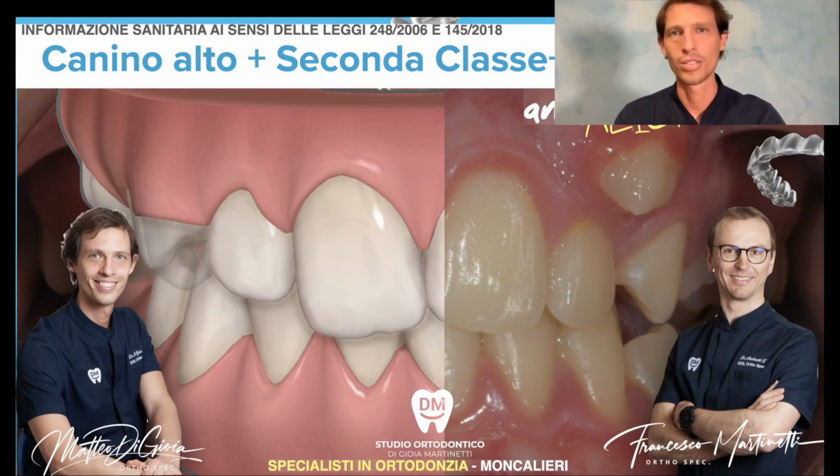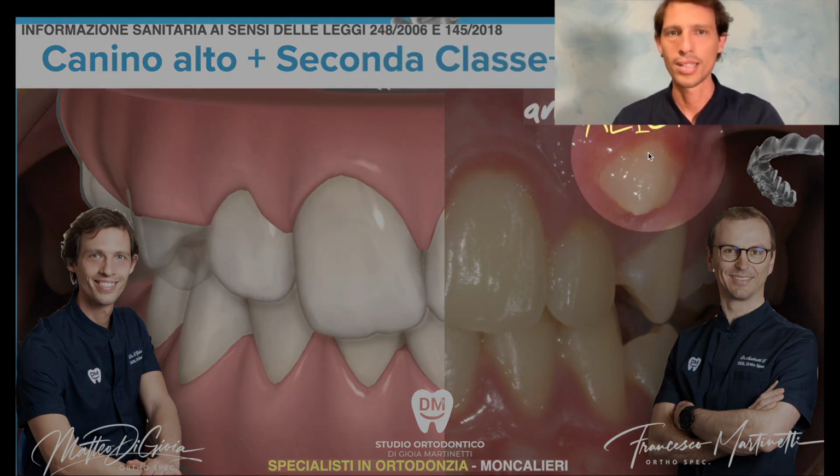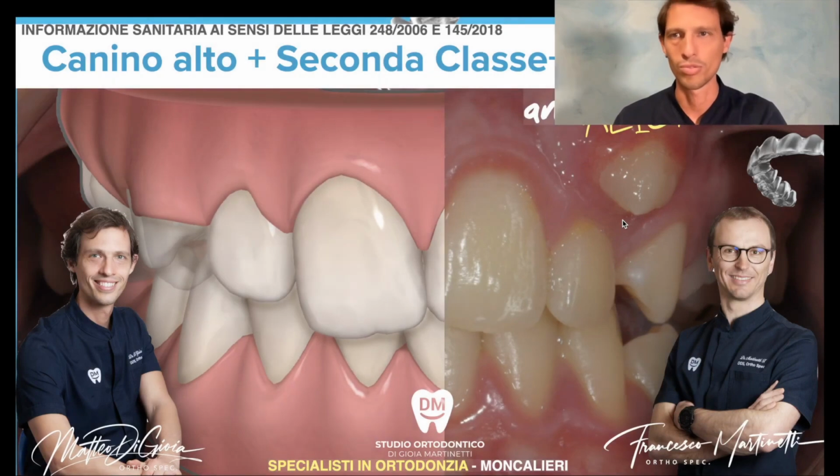Today we'll look at a case of a little girl with a class 2 malocclusion, meaning her teeth don't come together properly, with a canine, as you can already see here, that's very high and growing on the gum, because underneath there is no space for it to come out.